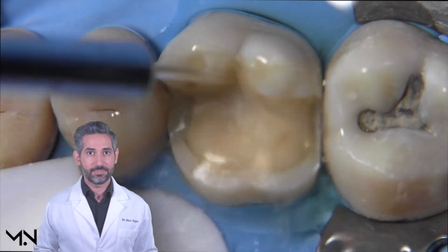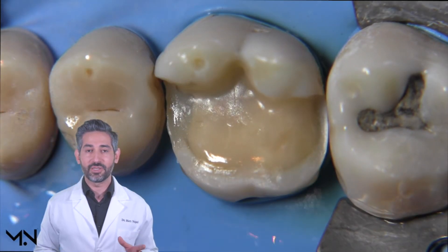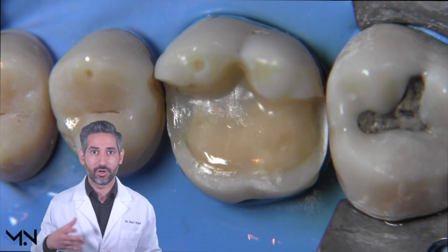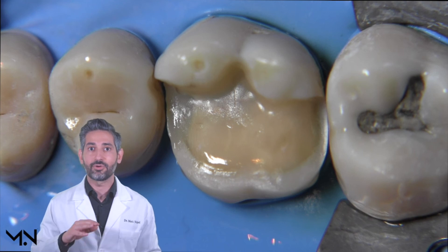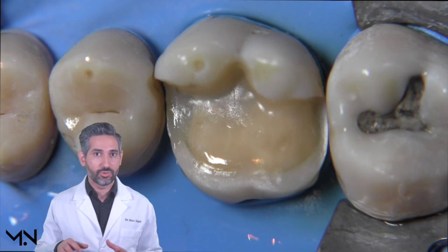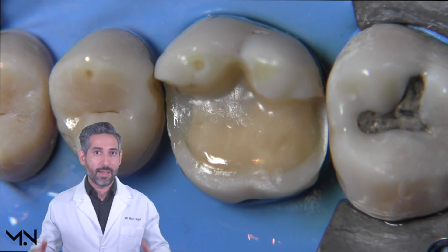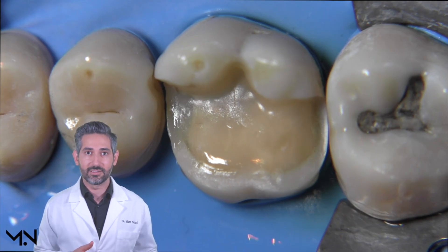You can take off your isolation, take an impression, and make a temporary. One very important tip: when you make your temporary, especially if you're using a resin-based material or bisacryl, apply some sort of separating agent like vaseline or glycerin so that your temporary does not lock on or stick. You can leave one or two areas that are okay for retention, or make sure your temporary locks into undercuts, but you don't want it to bond to the immediate dentin sealed layer.